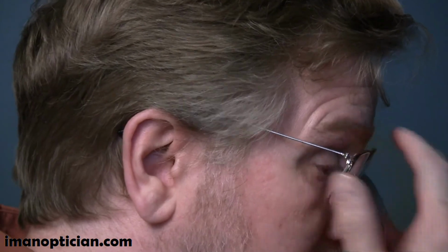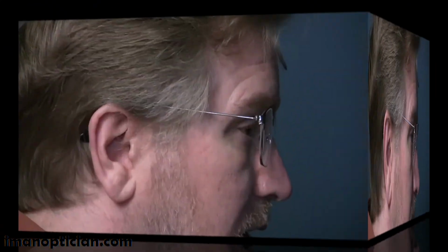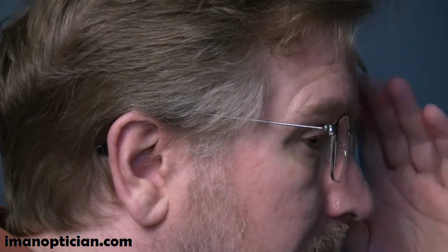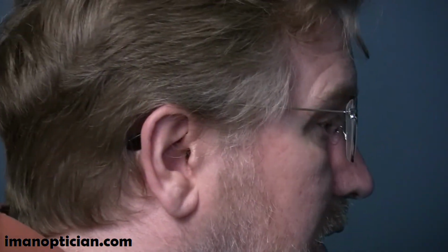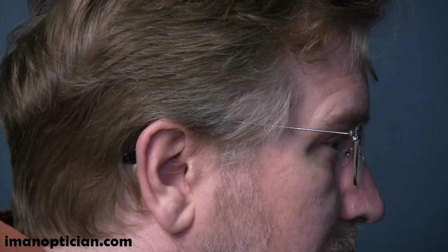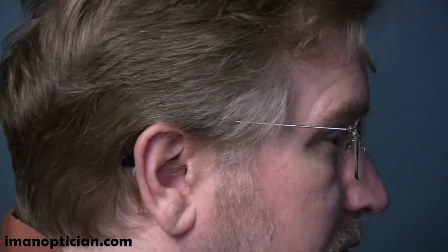By pantoscopic tilt, we mean the angle of the frames this way. They should not be out like this. This would be retroscopic tilt versus pantoscopic tilt. This would be an example of very high pantoscopic tilt. You can see it's very close to my cheeks down here and far away from my eyebrows up at the top. Here is an example of what we would call retroscopic tilt, very close at the top and very far. It's slanted out quite a bit that way. Retroscopic tilt is not something that would ever be desirable on a frame. We should always have some amount of pantoscopic tilt.